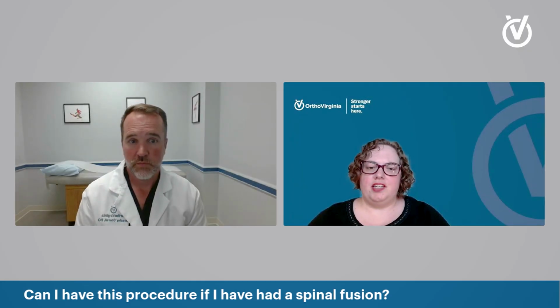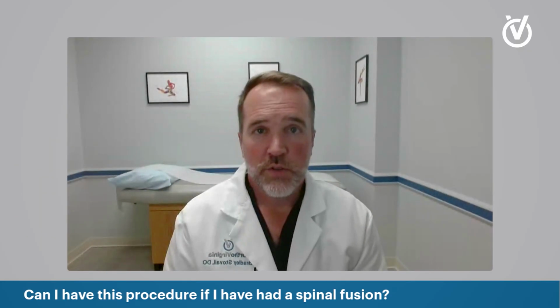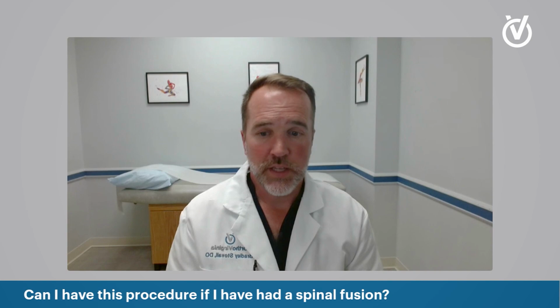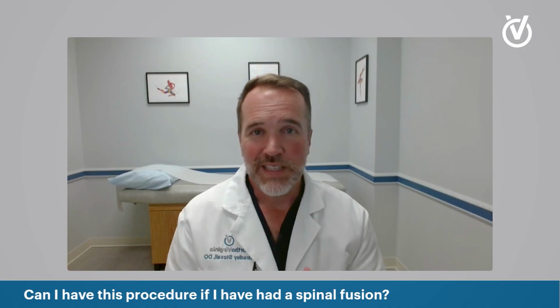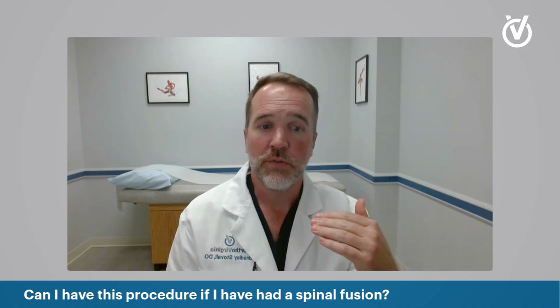Can I have this procedure if I have had a spinal fusion? So spinal fusion is done to help stabilize the spine and improve alignment. And so if you have screws into the bone, that's kind of the same area that we go with our equipment. So if you have a spinal fusion, we can't do the procedure at the level of the fusion, but typically when we see degenerative changes after a spinal fusion, it occurs above or below the fusion.